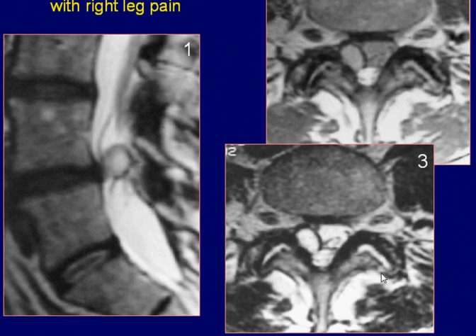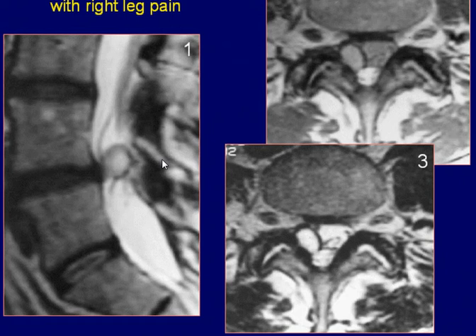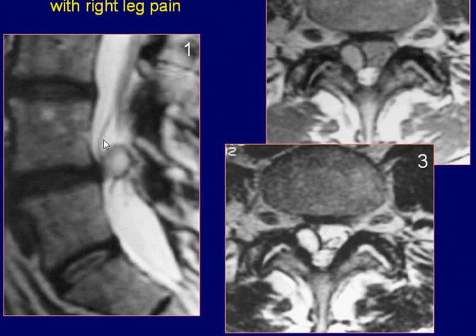This is a 57-year-old male with history of right leg pain. Sagittal T2-weighted image of the lumbar spine reveals a well-defined, roundish, hyper-intense lesion within the spinal canal at the L4-5 disc level. The adjacent nerve roots appear displaced.